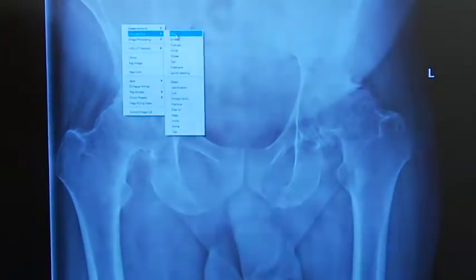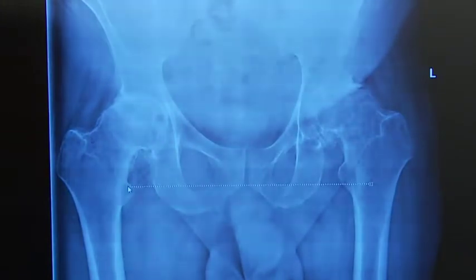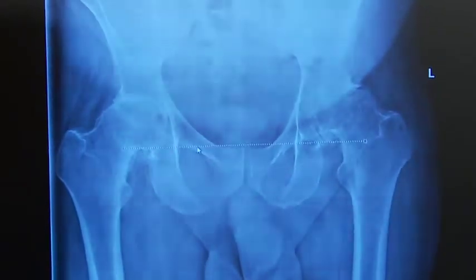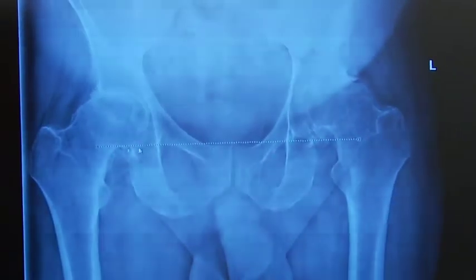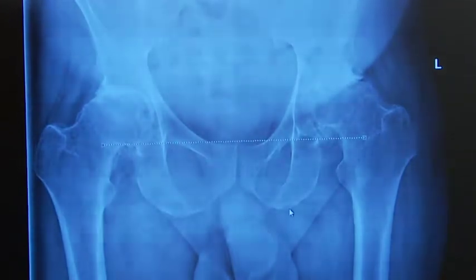that again, the first thing we'll draw is that trans teardrop line. His teardrops are a little bit difficult to make out given the severe osteophytic nature of his arthritis, but if we draw that line and then try to get a halfway happy medium between the trans teardrop and the bottom of the obturator foramina, you can see that his line lands, I'm going to move that up a bit, lands slightly above the top of his pubic symphysis, which is different than our last case.